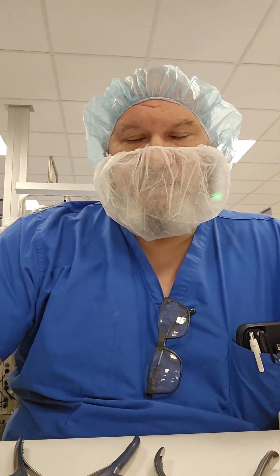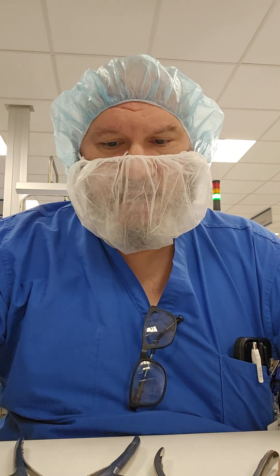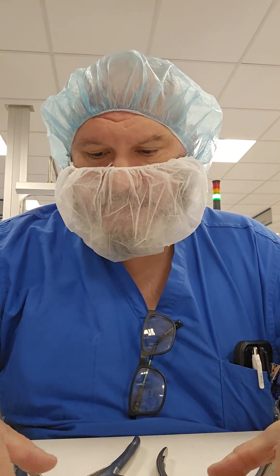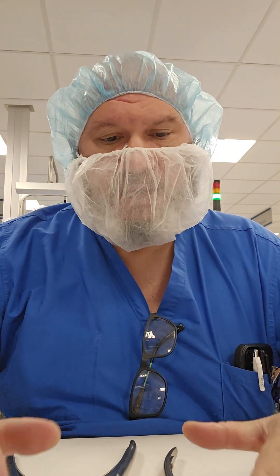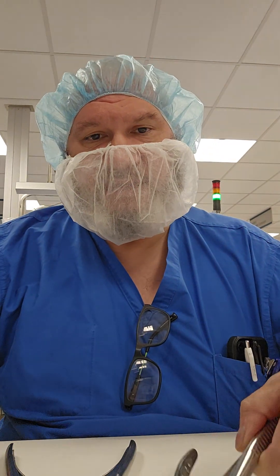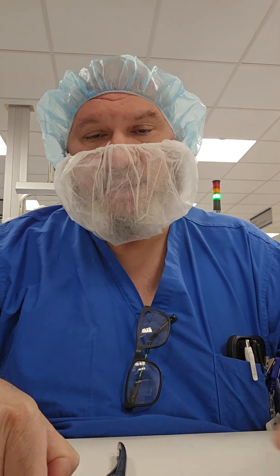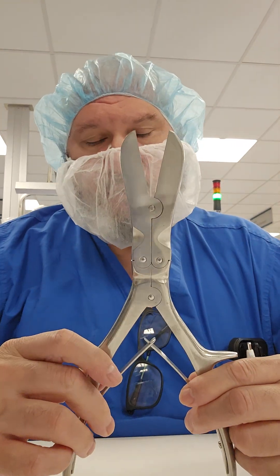Welcome back to WDYDCSP — What Do You Do as a Central Sterile Processor. Today I want to talk about the inspection and testing of two common ortho instrumentations: the Lexel bone rongeur and the Liston bone cutter.